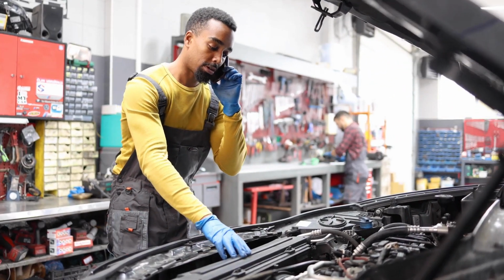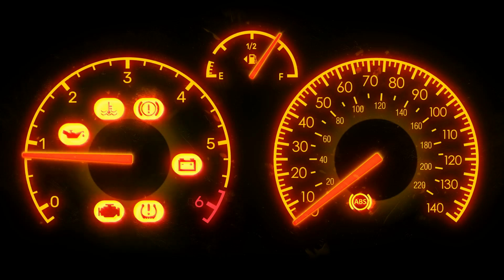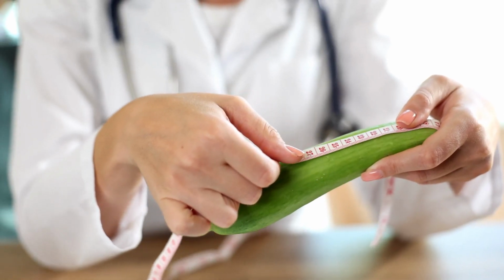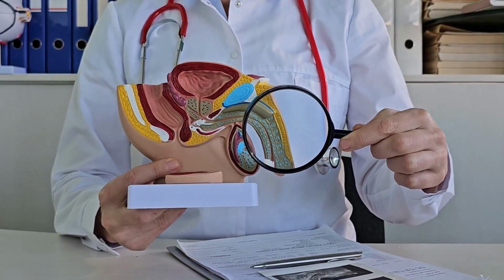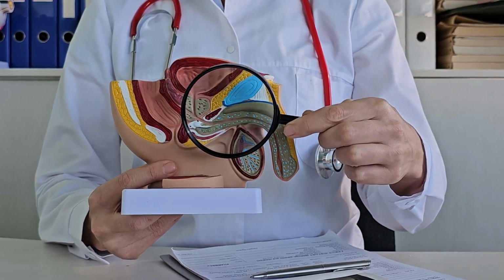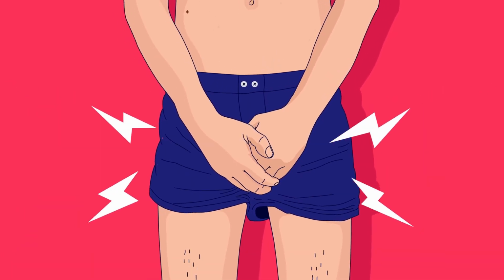Rates of reoperation due to mechanical breakdown is up to 15%, which can happen at any moment during the first 10 years. You will need surgery to repair or replace a small piece of the implant, or sometimes all the implant needs to be replaced, increasing the risk of complications. The size of your penis will not increase with the penile prosthesis. During the surgery, penile length is measured, and the longest size possible is placed.